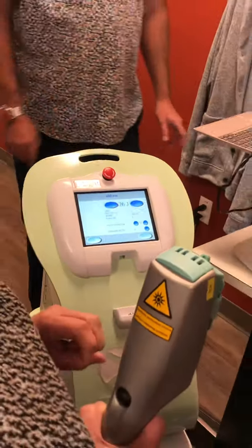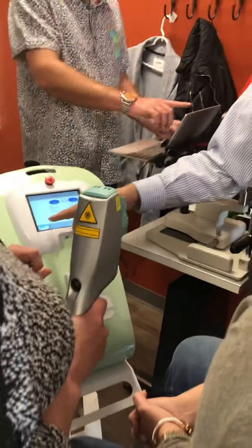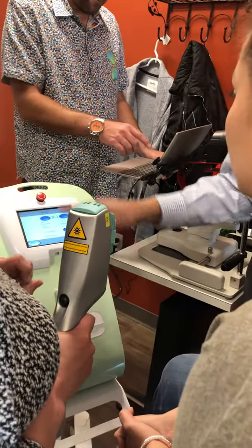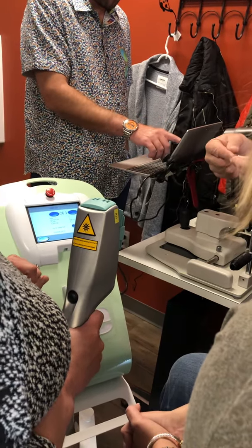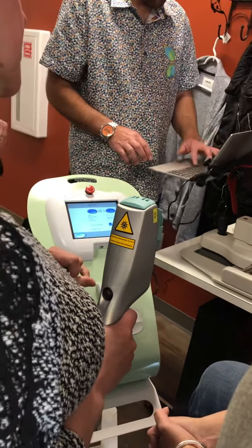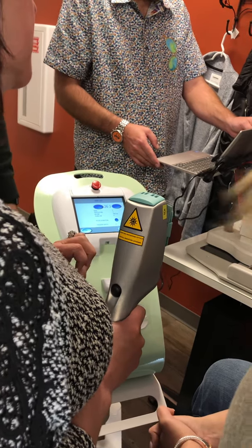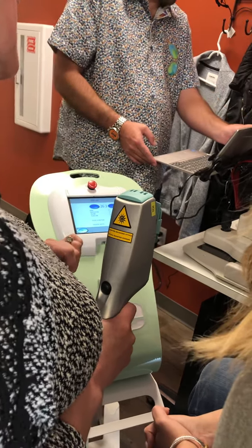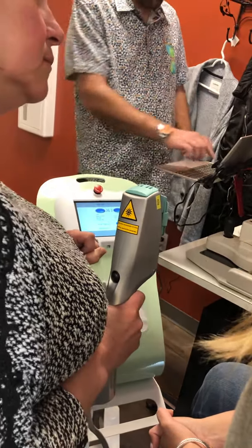All right. So, again, from my doctor's perspective, the treatment is from the time at which you hit enter and you push the button. It isn't the number of spots you do. It is the fact that we are now in a treatment modality. So when we do an IPL for dry eye, we do 5 spots on each eye. That would be 10. But if I looked at this and said, well, ma'am, do you like the hair on your lip?